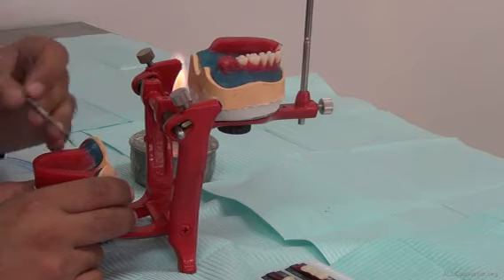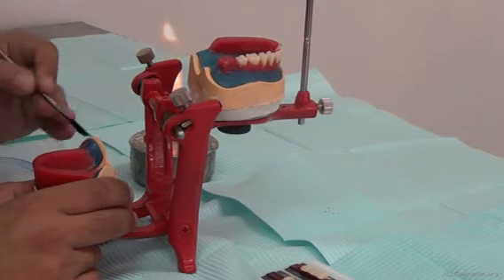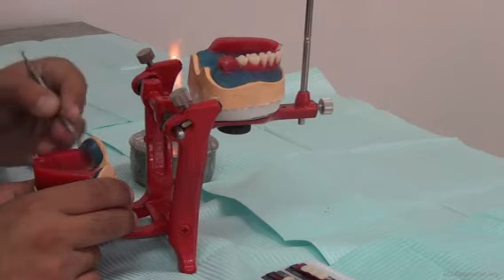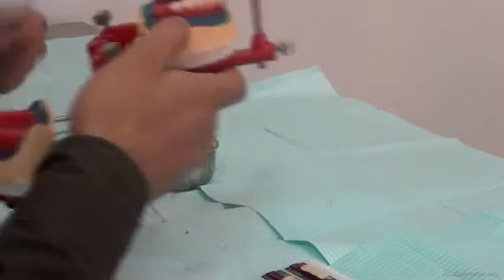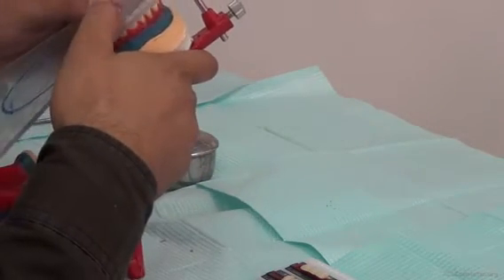For setting anterior teeth, we have to check that the lower wax rim is totally clean, because we want to make sure that it's totally flat and its relation with the upper teeth is correct. Then we check the upper. We put the upper on the glass slab. We make sure that all of the rules of setting apply.